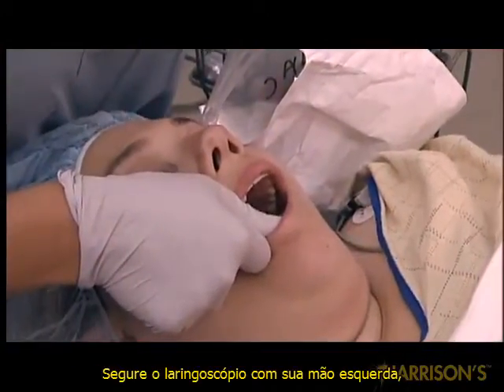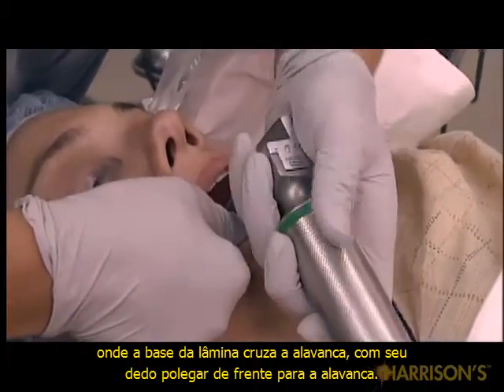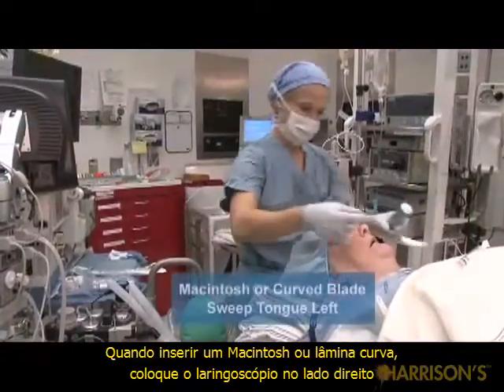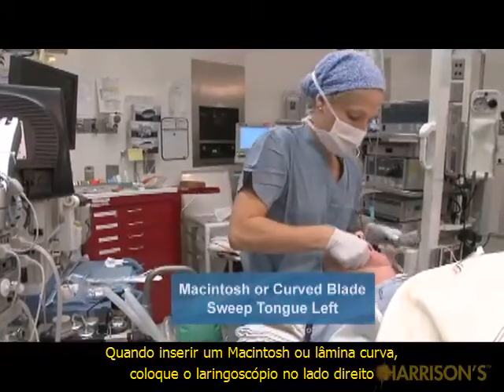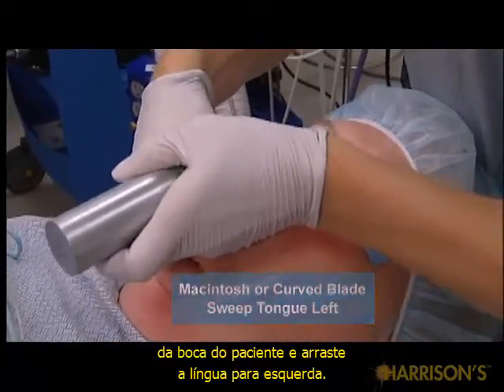Grip the laryngoscope with the left hand where the base of the blade intersects the handle, with your thumb facing up on the handle. When inserting a Macintosh or curved blade, place the laryngoscope in the right side of the patient's mouth and sweep the tongue to the left.